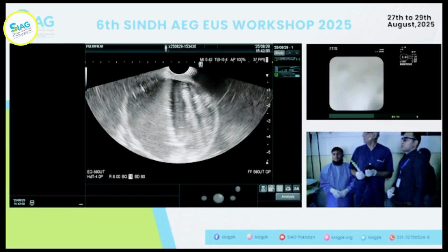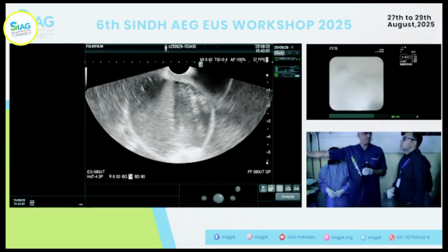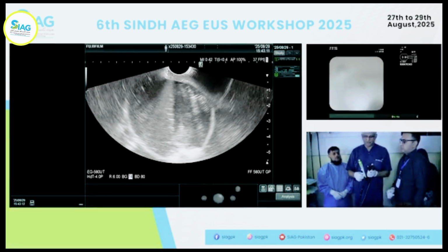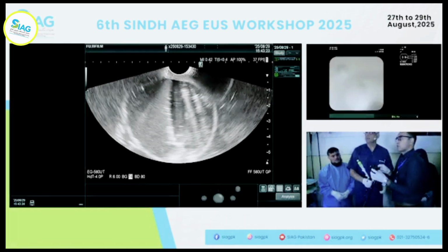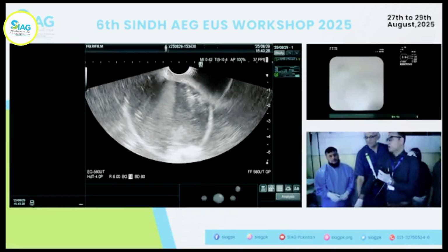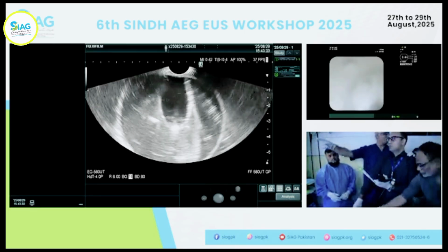So what I do is I leave my, this is what I do, and I'm sure there may be. So this is good enough for me. I know my sheath is good, so here I would lock, right? Chalo. This is locked. So now you're in a good position. Remember, your big wheel and all make a difference, right? If you're happy, I am happy at this position. This is what I would want.